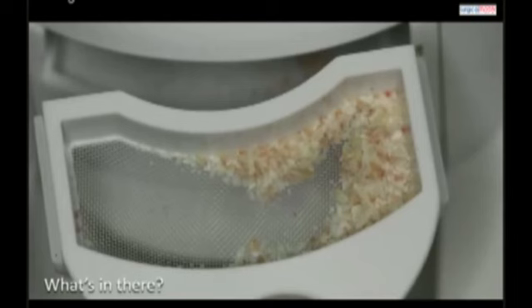It's pulverized into small particles of the ideal size for a bone graft. It's not a bone graft, it's a tooth graft, but don't forget we also have some organic tissue in there. And for that purpose, we need to use a dentin cleanser to clean out all the organic material. It's a process that takes about 10 minutes. And then we use a buffering solution to buffer the pH.